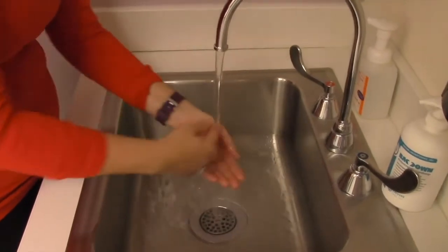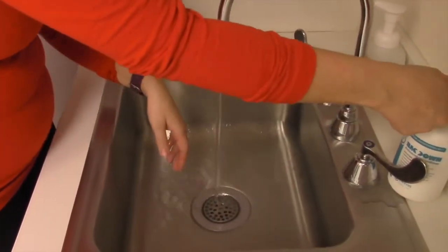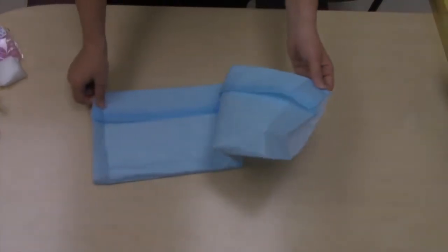First, both of you should wash your hands thoroughly with soap and warm water. We recommend finding a comfortable seating place for you and your child to sit with a table nearby to put the supplies on.